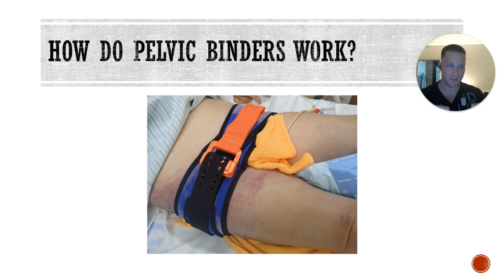Don't make the mistake that everyone makes initially, which is, well, I put the pelvic binder on so they're not going to bleed anymore. That's ridiculous. This is not a tourniquet. Don't think like that. Put the pelvic binder on, and you need to keep going, because that alone will not save them. And we'll talk about that at length later.